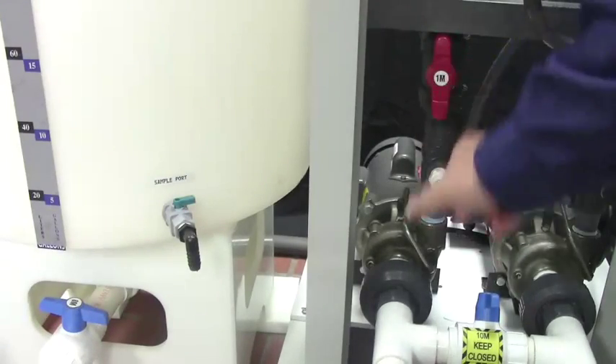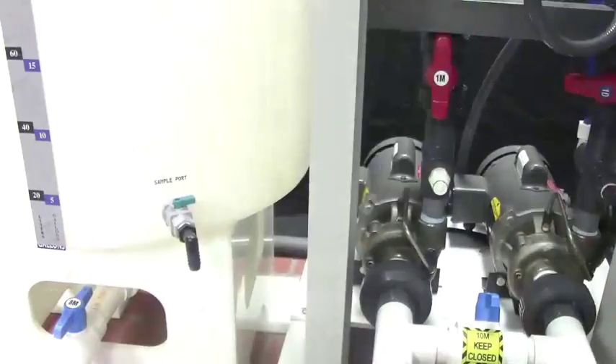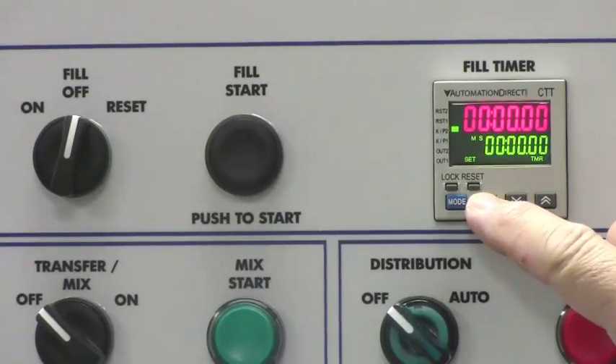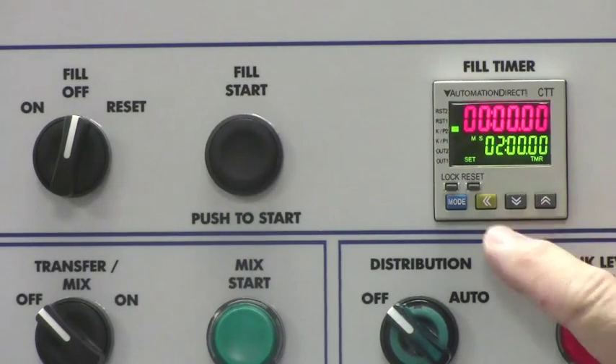Open valves 1M, 8M, and 4M. Set the fill timer based on your desired batch size, less 1 to 3 gallons.